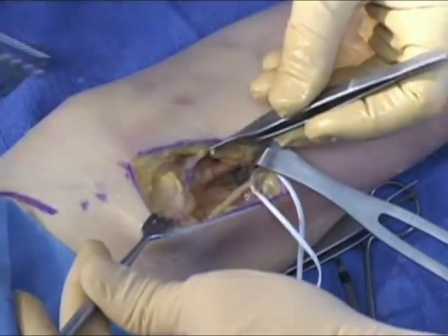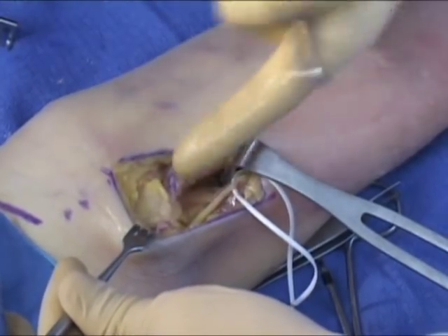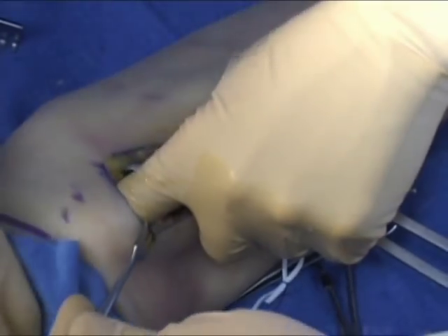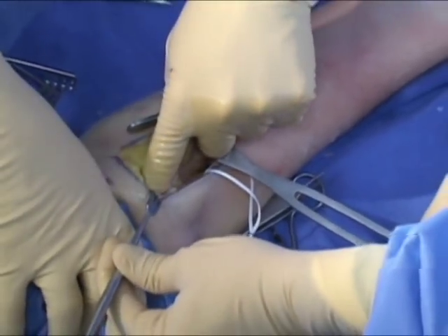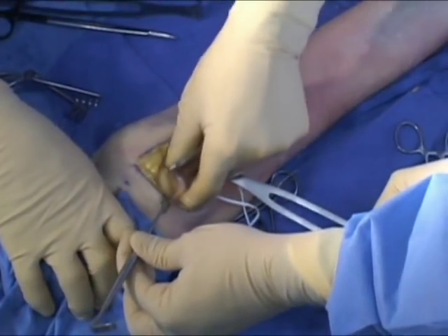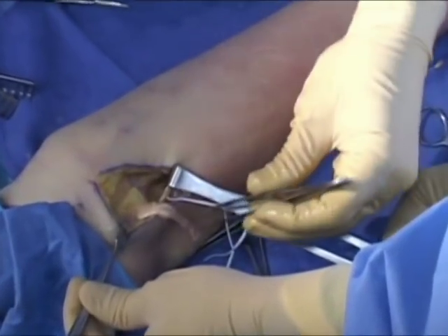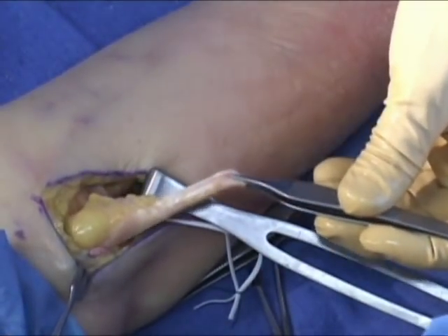The lacertus fibrosis is identified, which leads the examiner to the ruptured biceps tendon. Careful dissection below the subcutaneous fat allows for palpation of the biceps tendon, which can be withdrawn distally. If still attached, the lacertus fibrosis prevents proximal retraction of the biceps tendon and ensures easy retrieval at the time of surgery. The tendon can be delivered onto a cotton gauze in preparation for suturing.